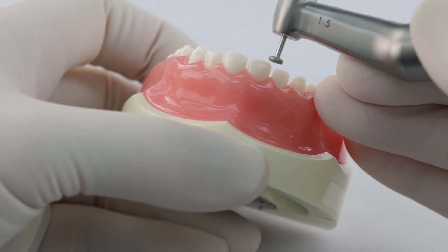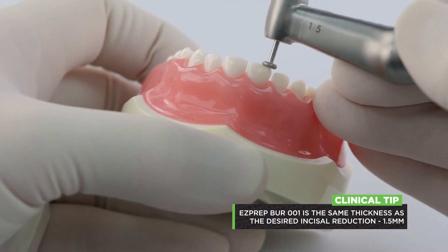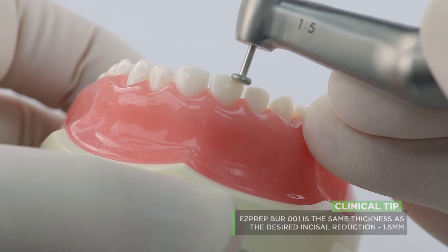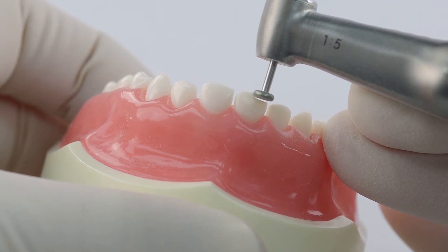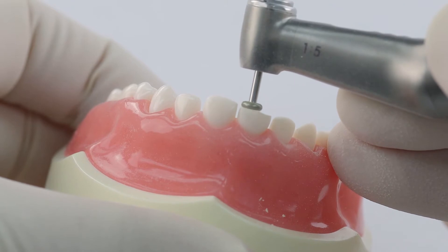This burr is a millimeter and a half thick — use that to your advantage. What you want to do is just make a little notch at the incisal edge, and the top of that burr should line up with the incisal edge of that tooth. You can see that right there — it's just the depth of that burr. And then you're just going to mow off the rest.